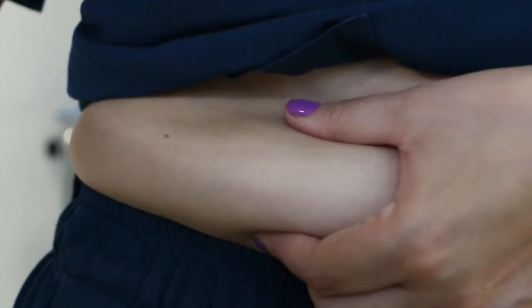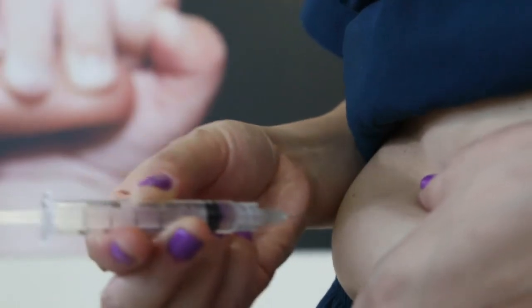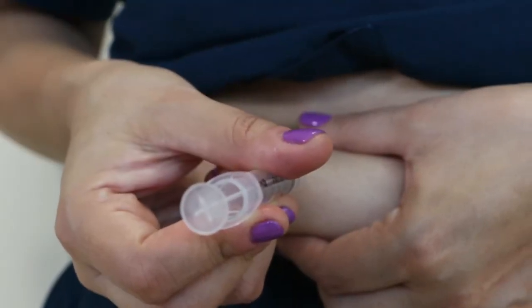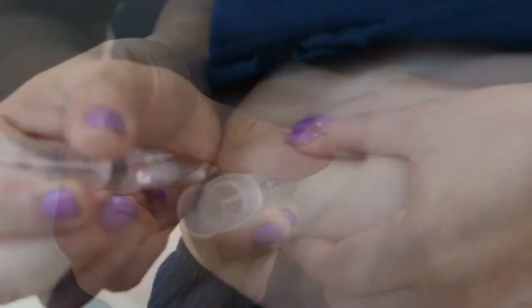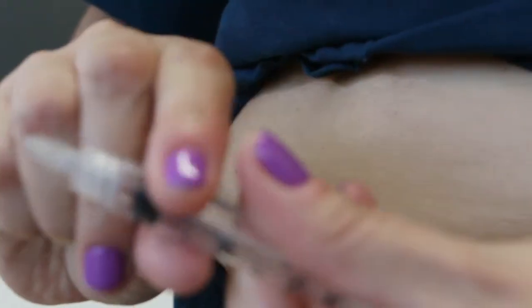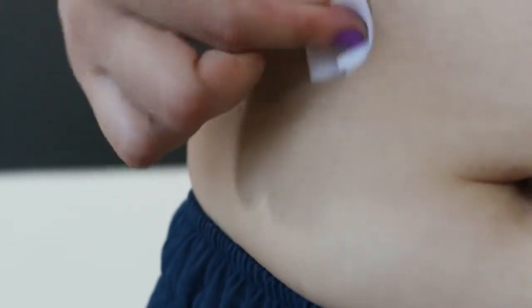Take a small amount of skin with your fingers and with your other hand hold the syringe at a 90-degree angle. Inject and hold the plunger down for 3 seconds. Finally, remove the needle and then remove your fingers from your skin. You might need to clean the area again with a swab.